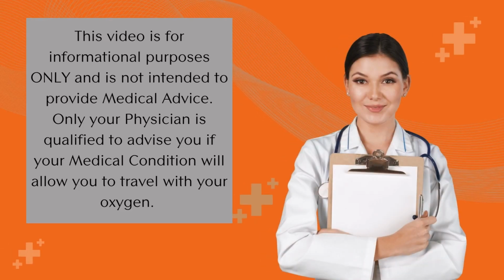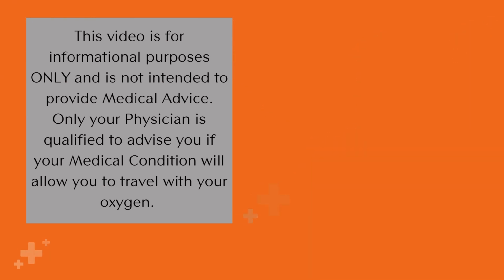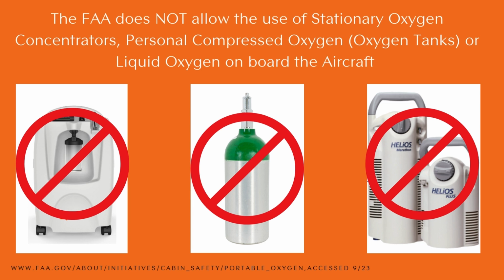This video is for informational purposes only and is not intended to provide medical advice. Only your physician is qualified to advise you if your medical condition will allow you to travel with your oxygen. The FAA does not allow the use of stationary oxygen concentrators, personal compressed oxygen tanks, or liquid oxygen on board the aircraft. You will not be permitted to board the aircraft with this equipment. Only a portable oxygen concentrator that is qualified can be taken on board the aircraft.